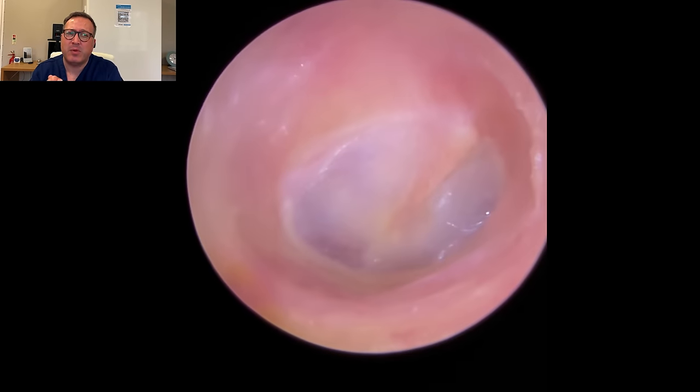That block's come away. The eardrum itself looking good - a little bit of oily discoloration to the top of the canal wall, but much better light reflex. And there we are - you can see what we removed: quite a bit, just under two inches, just under five centimetres of stuff that came away. But as always, take care of yourselves and one another, and I shall see you again real soon.